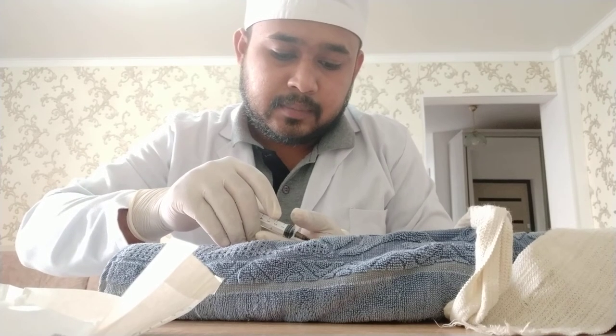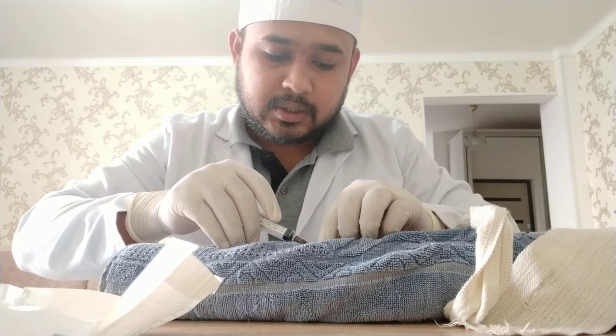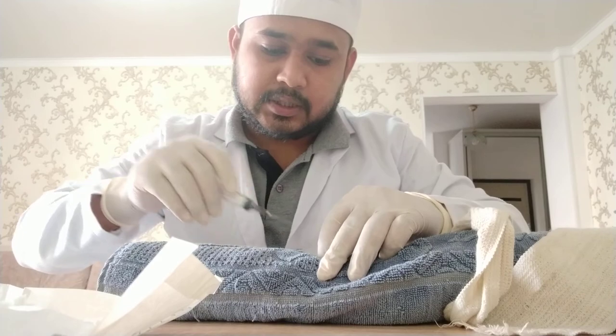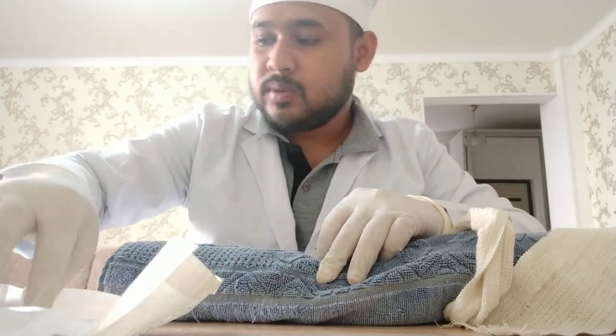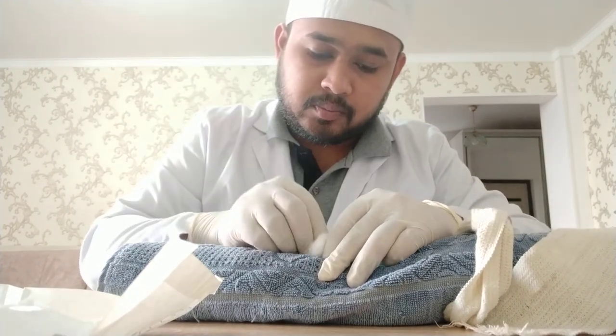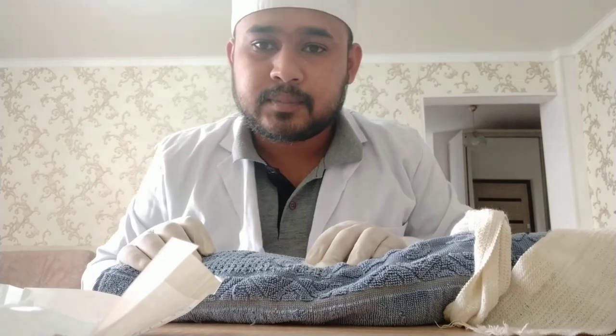Free your hand. Put your left hand into the part of the injection and pull the injection out easily — keep the injection in the dustbin. Put a cotton ball and then press it down and ask the patient to hold his hand like this. That's it — it's all about IV. Thank you.